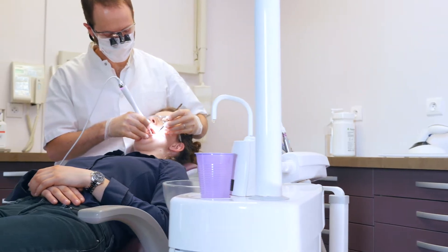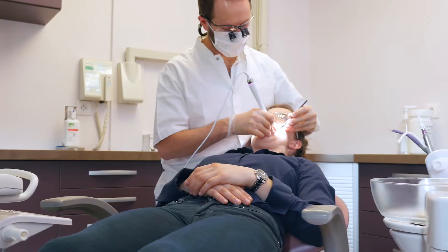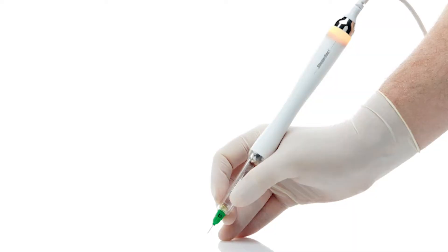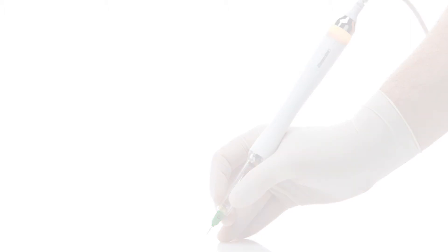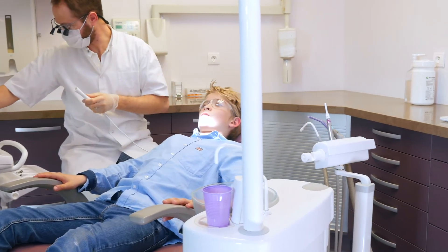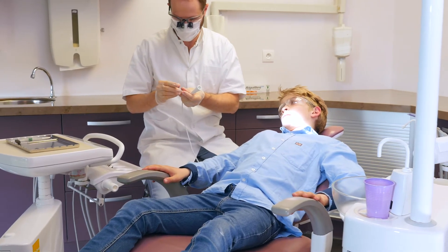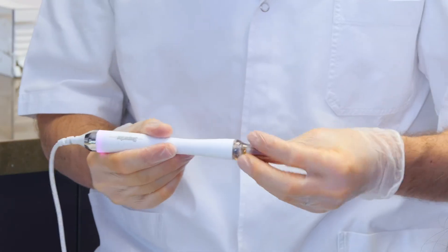With Sleeper One Five, the syringe of today is no longer a syringe. The pen grip ensures high precision injections for really painless anesthesia. Electronic anesthetic injection control increases success, eliminates pain, and improves the experience for both patient and dentist.